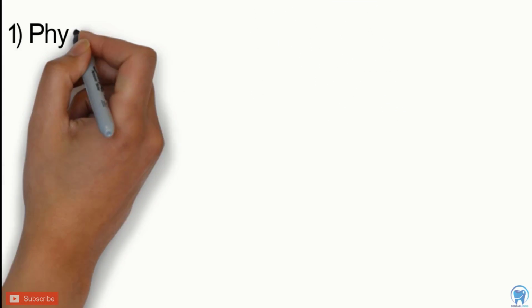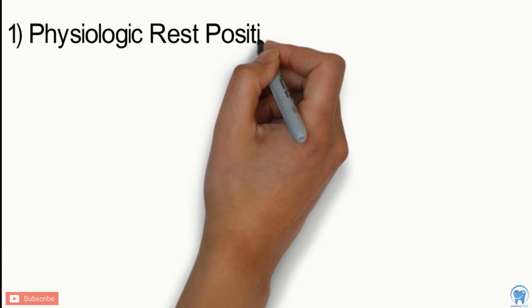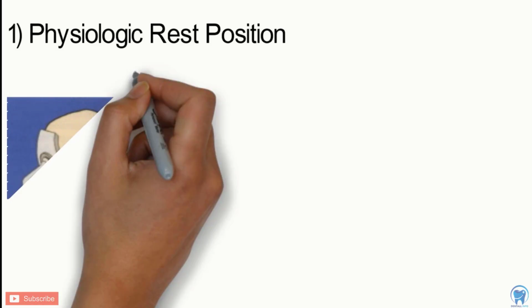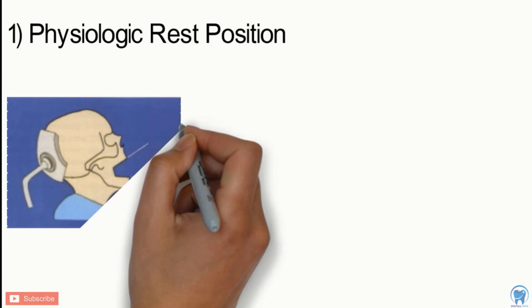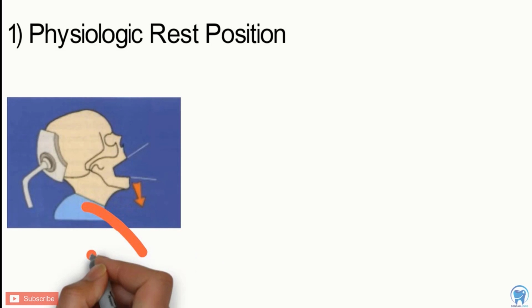The other category of methods that can be used includes physiological methods. The determination of the vertical dimension of occlusion using the vertical dimension at rest and interocclusal rest space is also used many times. To determine the vertical dimension at rest, the patient should be asked to relax with trunk and head unsupported. After insertion of the occlusal rim, the patient should be asked to swallow and let the jaws relax.